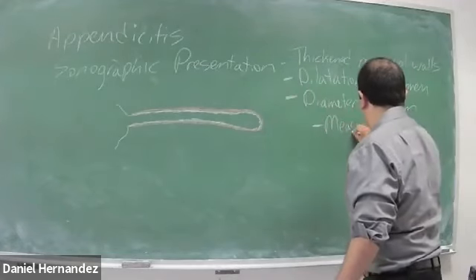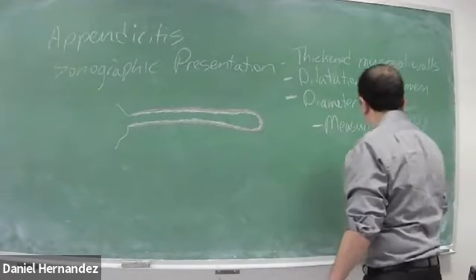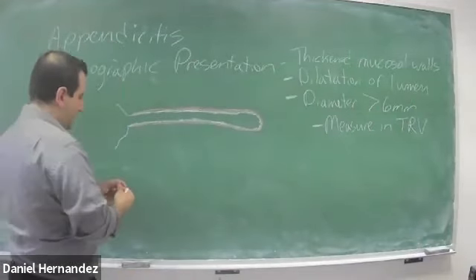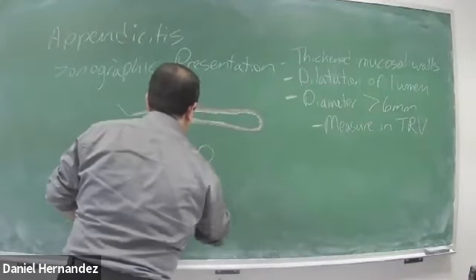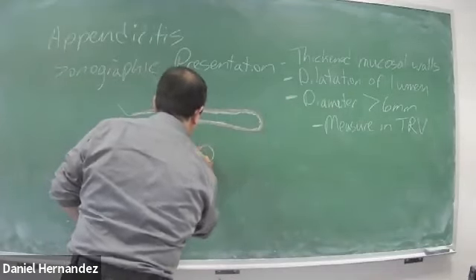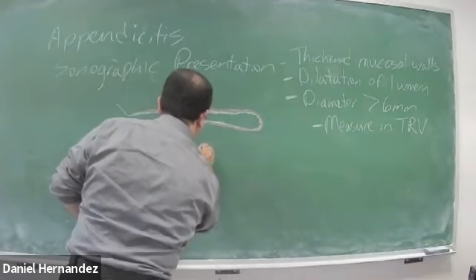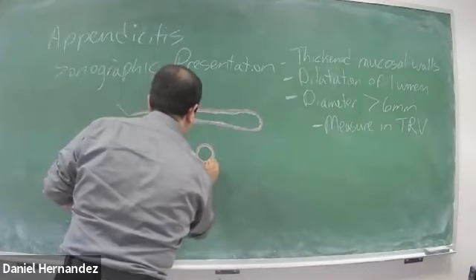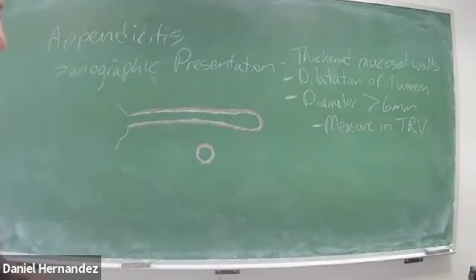Measure in transverse. If we take this appendix and do a transverse image, the measure will look something like that.